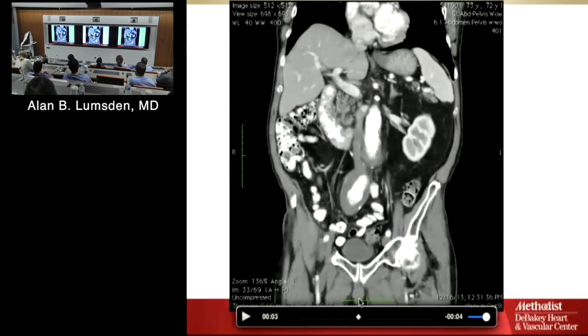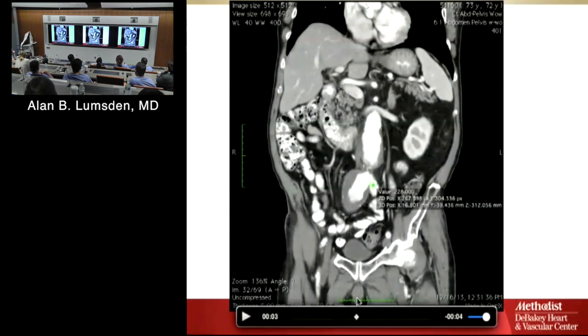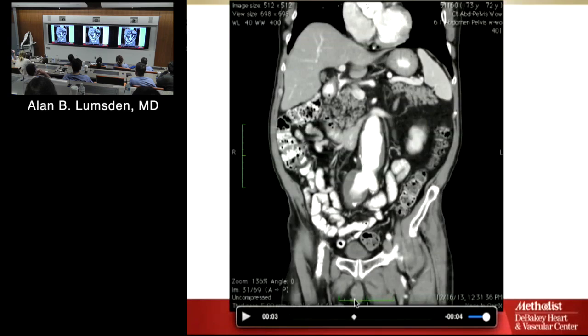Now let's look at the superior mesenteric. There's the left renal vein. You see it? I'm afraid to let this thing go. It jumps. But look at this. There's the gonadal vein we were talking about. That's the left renal vein. What's that?